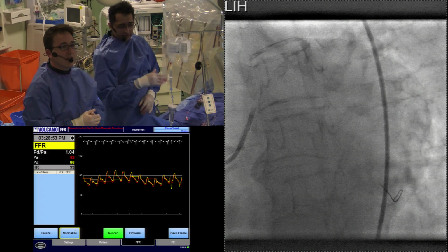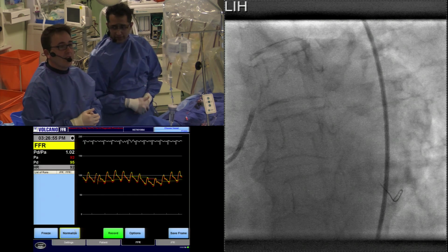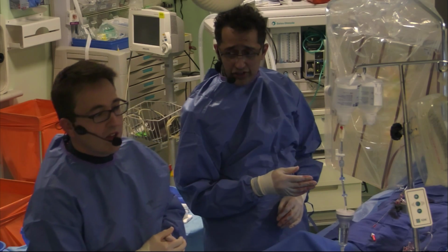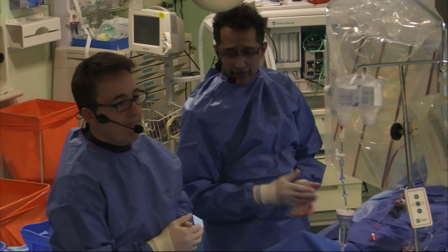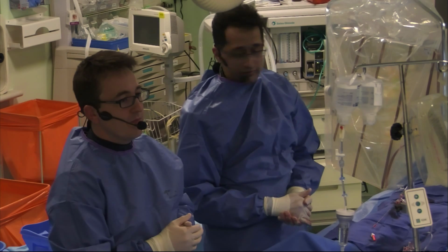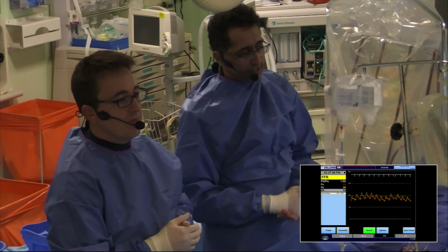So basically, I'm sure it was up against the side wall. We're fairly far down. There have been quite a few bends in the vessel, and whenever I see that, all I'm doing is moving the wire back just a fraction. So centralize it in the lumen rather than it smacking against the side wall of the artery, and that's all it's taken. It's taken about 5 millimeters of pullback. I was well beyond the lesion of interest anyway.